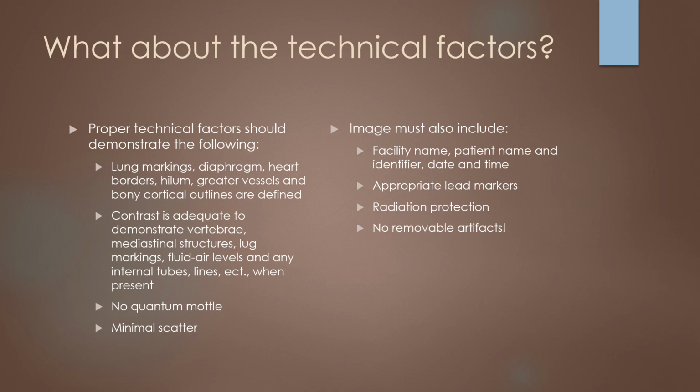We need to make sure that we have demonstrated air fluid levels, internal tubes, etc. There should be no quantum mottle and minimal scatter. We also must adhere to the legalities of all of our imaging studies.